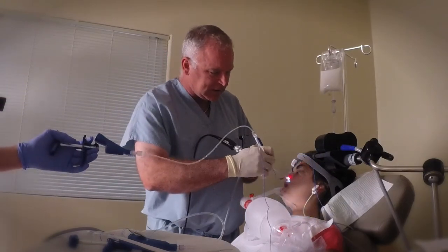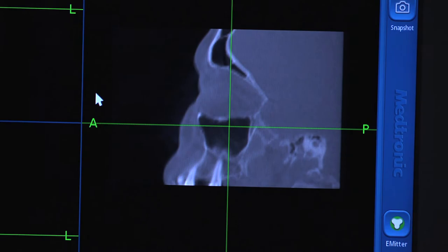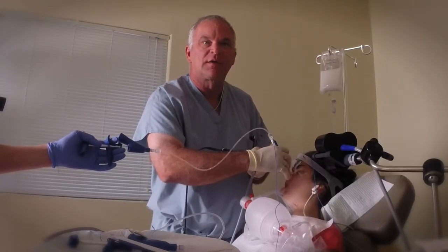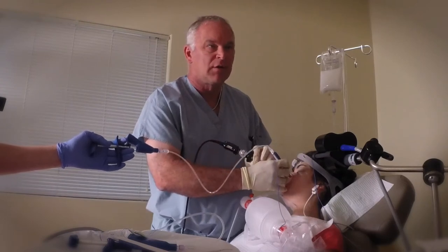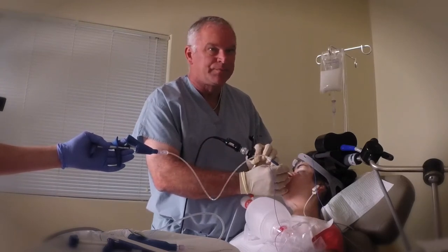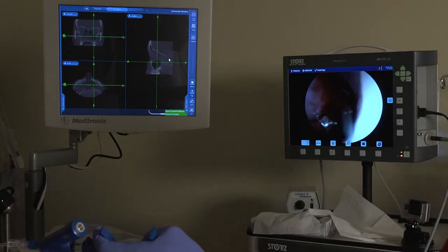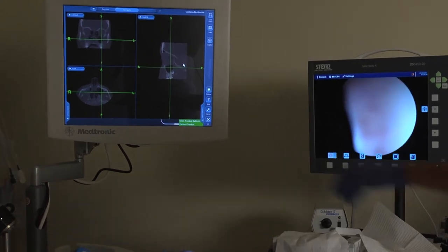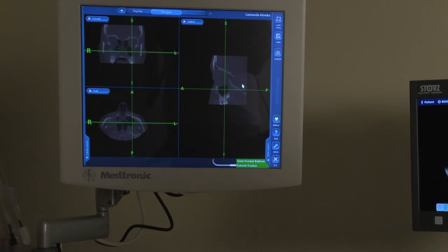Now we're going to what's called the maxillary sinus. Again, here's the middle turbinate. The maxillary sinus is going to be just over in here. I'm going to try to find the natural osteum. If you can look at the upper screen — you can see the green axis within the air, and the black is the sinus.